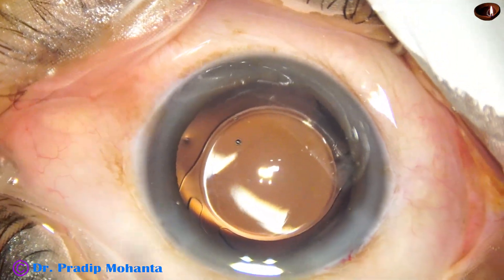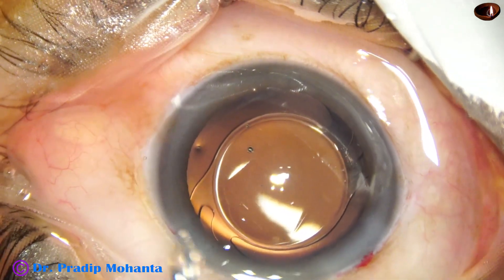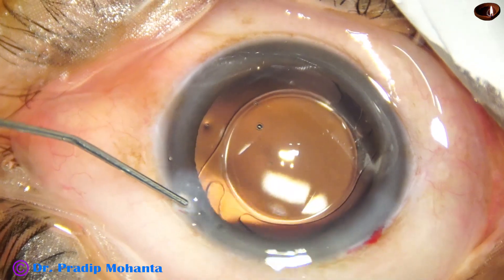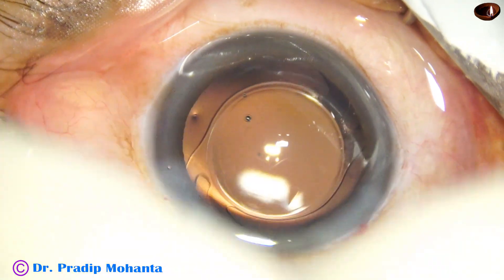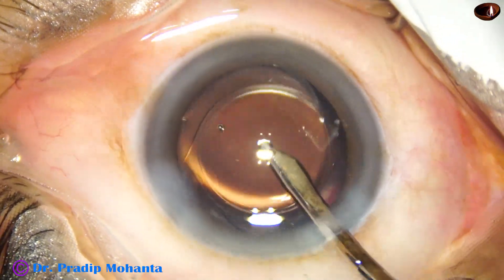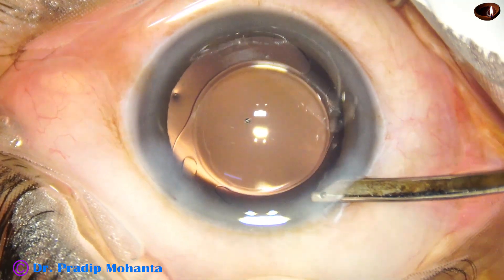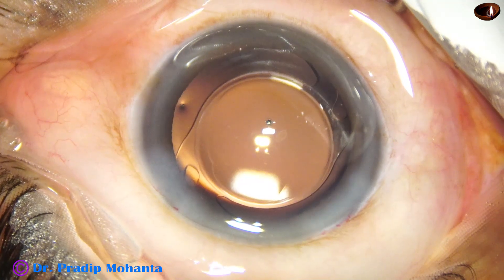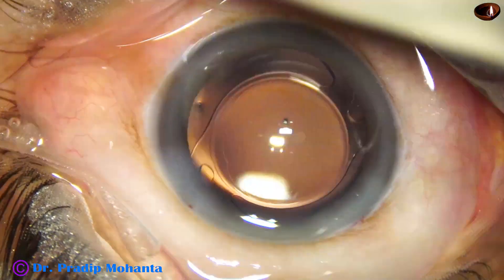Whatever viscoelastic molecules are there in the lumen of the cartridge are irrigated out. This is the antibiotic moxifloxacin. The side port is closed by corneal stromal hydration and we are done. A final lavage of the anterior chamber — the anterior chamber is formed nicely and the case is concluded. In this video we have seen the use of two nucleus sustainers: a longer one for pre-chopping, and then management of the segments by the shorter 1.7mm pre-chopper.